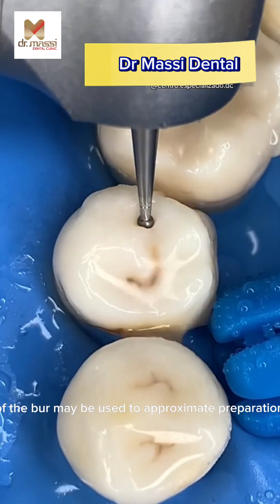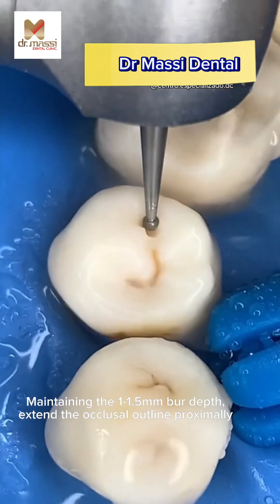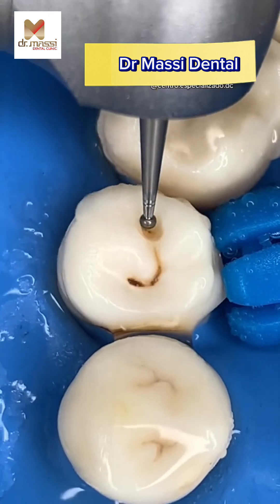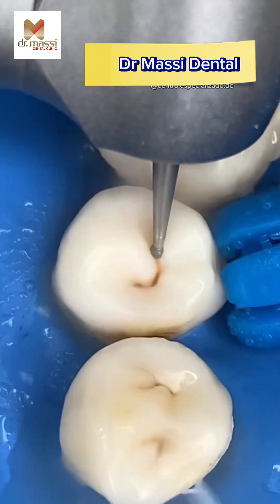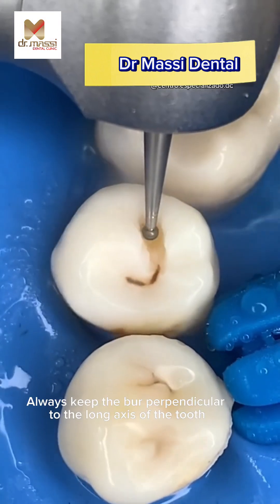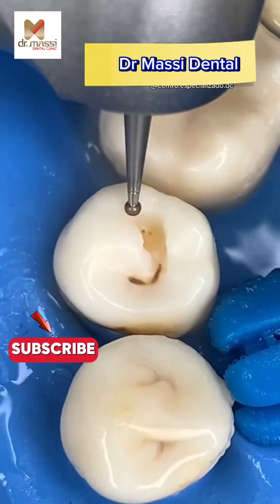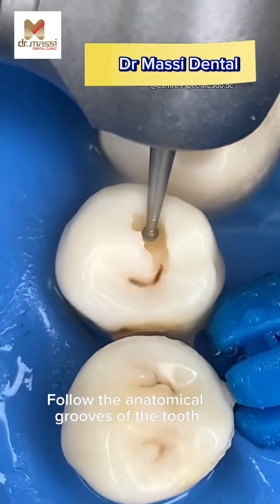The length of the burr may be used to approximate preparation depth. Maintaining the 1 to 1.5 mm burr depth, extend the occlusal outline proximally. Always keep the burr perpendicular to the long axis of the tooth. Follow the anatomical grooves of the tooth.